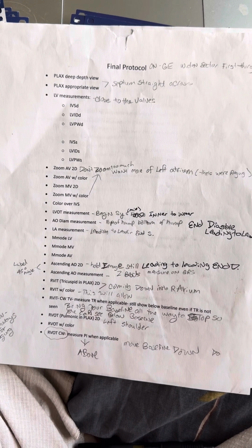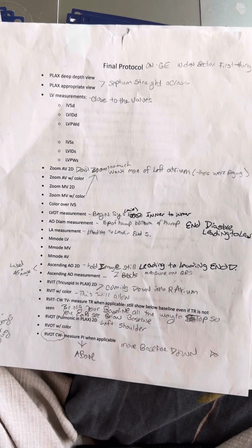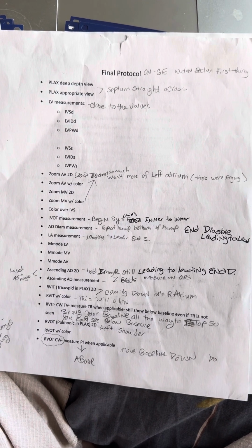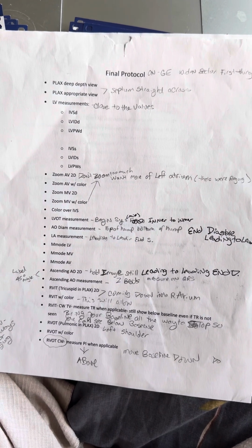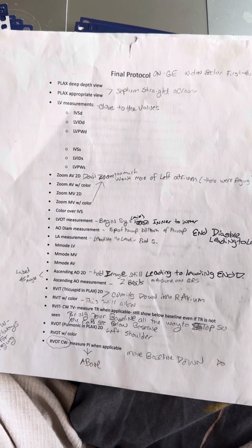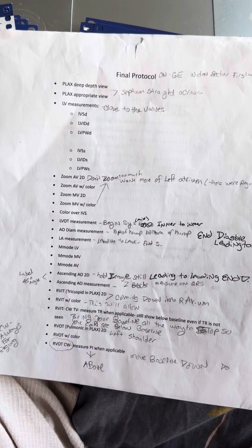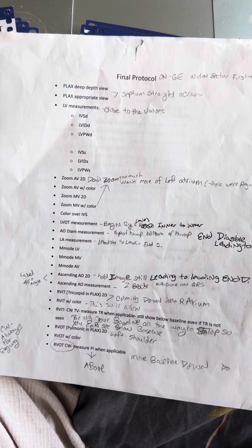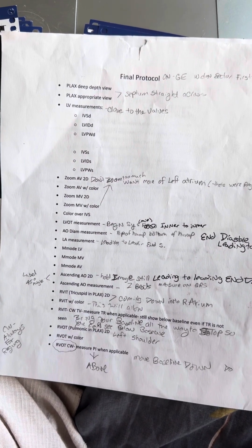Your aortic diameter should be top of hump to bottom of hump, end diastole, leading edge to leading edge. Your left atrium will follow that, leading to leading, end systole. Don't forget to M mode your left ventricle.